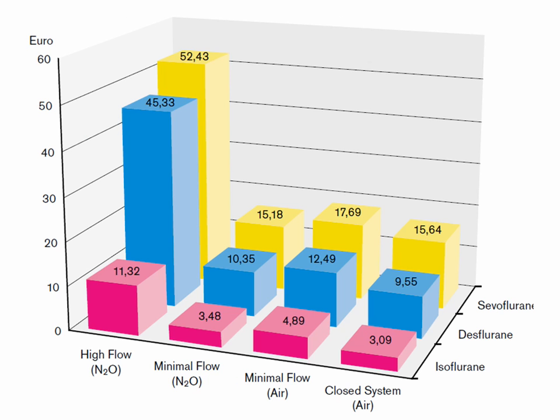This is how much a typical anesthetic would cost for 2 hours. This is the high flow, so 4.5 litres per minute using nitrous oxide. Minimum flow, and without nitrous oxide with minimum flow here. And as I mentioned, the closed system anesthesia. So there is a significant portion that you can save. As you can imagine, 2 litres per minute that I've seen a lot of maintenance flow rates would probably sit around here.